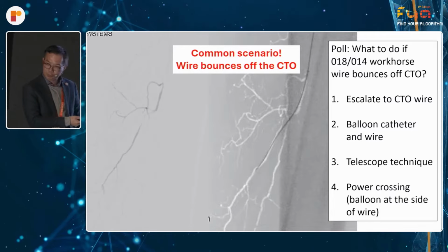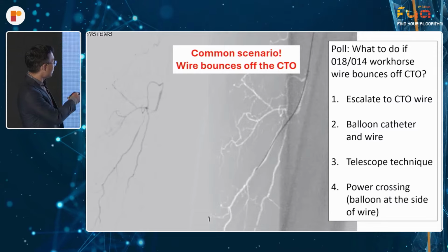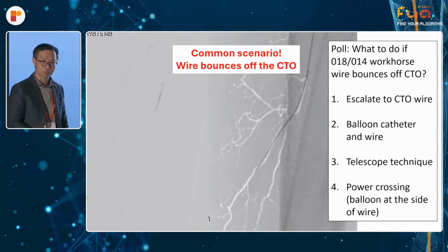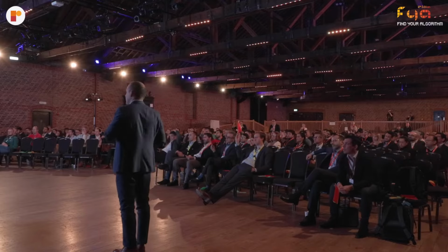So the first option, in this case, would you then escalate to a CTO wire? In this case, this is a peroneal artery. Raise your flag if we escalate to the CTO wire, or use another wire with different properties. Yeah, I see a few hands here. Very few hands. Balloon catheter and wire?